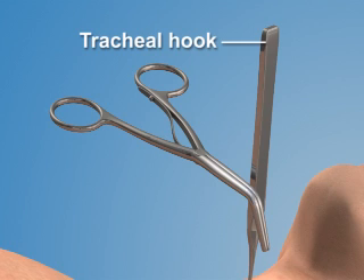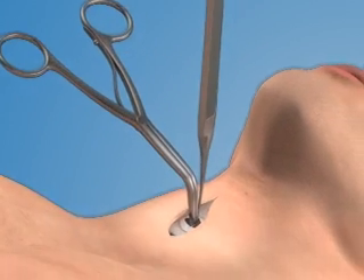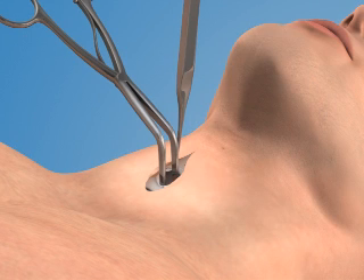While holding the hook with your non-dominant hand, use your dominant hand to place the trusodilator into the trachea. Spread the blades open to dilate the opening in a vertical direction.